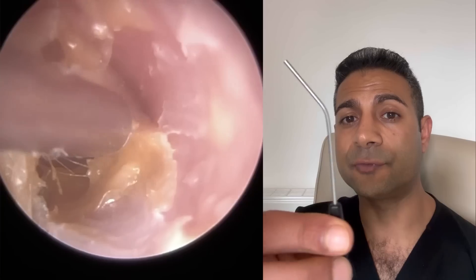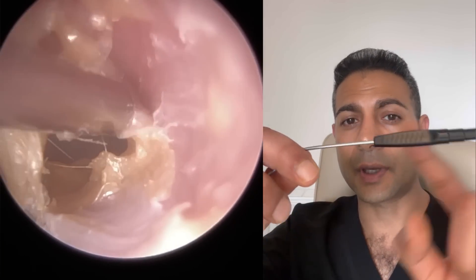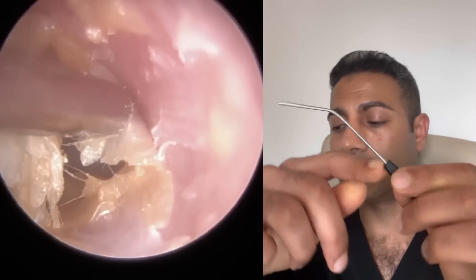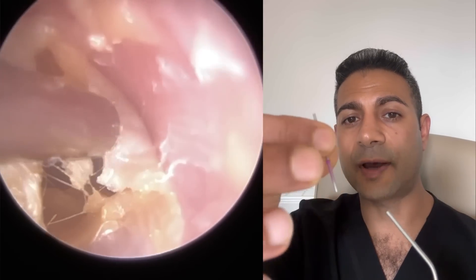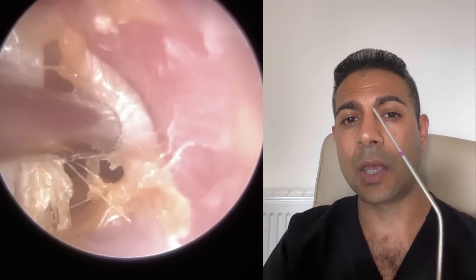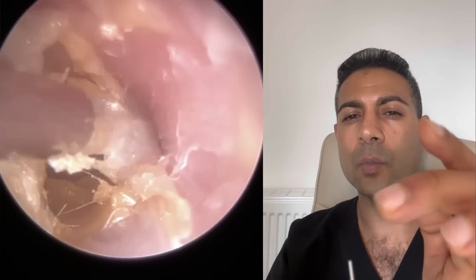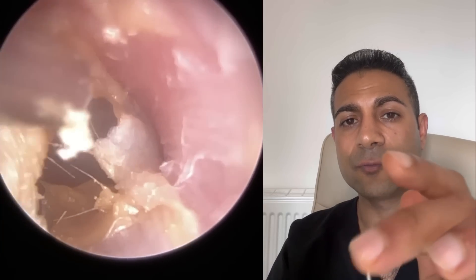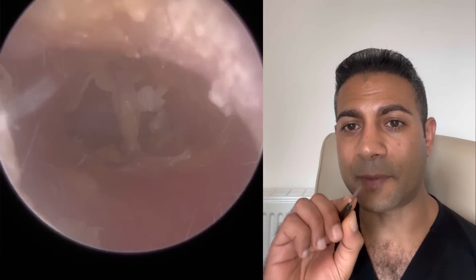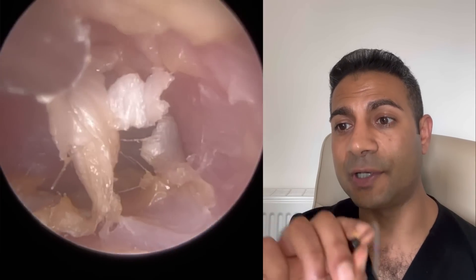I'll just show you that actually. So we've got a zolnir suction probe here — you've got the handle, and in the UK it's integrated, injection moulded or bonded, and then you attach a fine end. A fine end is an extension; it's a push fit — you simply push it on. It's a lot narrower; the tip of the fine end is about 1.3 or 1.4 millimeters in diameter. But the problem with this system is that it makes the suction probe longer, which makes it sometimes more difficult to control in the ear, particularly when you're near the eardrum.